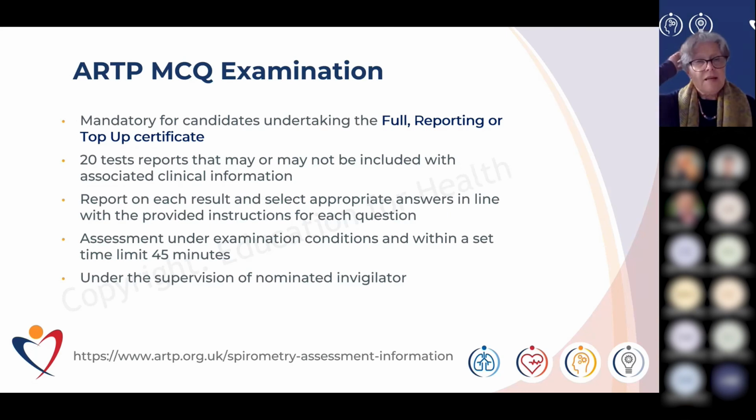So the MCQ examination then, it's mandatory for candidates undertaking the full and reporting and top-up certificates. You're given 20 tests, reports that may or may not include clinical information, but you will be given as much information as you need in order to interpret. You need to report on each result and select the appropriate answers in line with the provided instructions for each question, and it's under time as well. So you need to interpret 20 tests in 45 minutes.